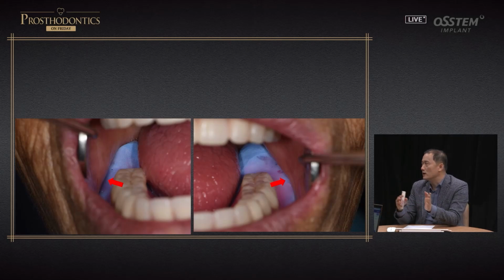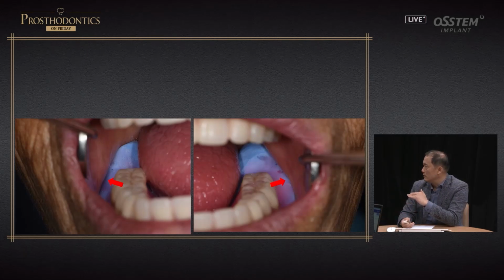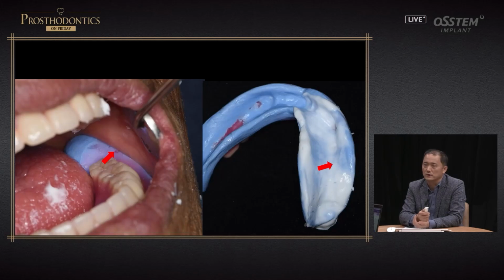But for this patient, through functional impression, you have a wax denture, and you deliver it in the mouth. On the right side, it is in harmony with the tissues and the margin is okay, but on the left, the margin is overextended. So this shows that border molding was not done very well. With the fit checker, like this, there is a bit more pressure pushed down, and that's not really good.